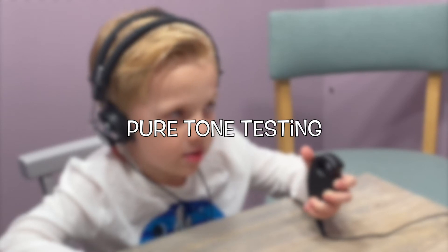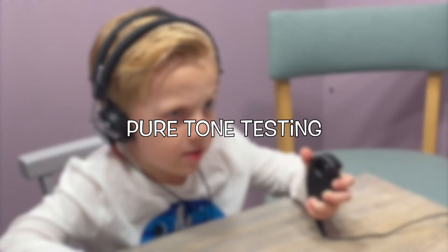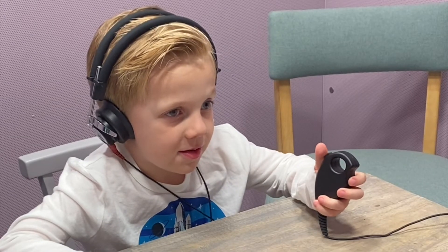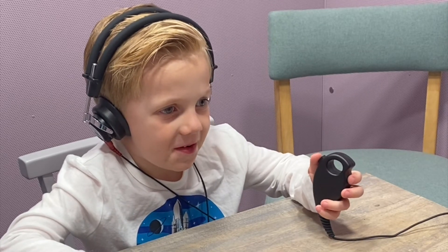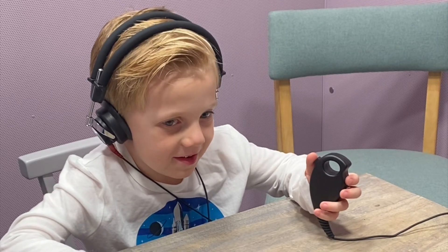After speech tests are performed, we move to pure tone testing. Here the child can either wear headphones or insert earphones. They can push a button or raise their hand when they hear the sound.